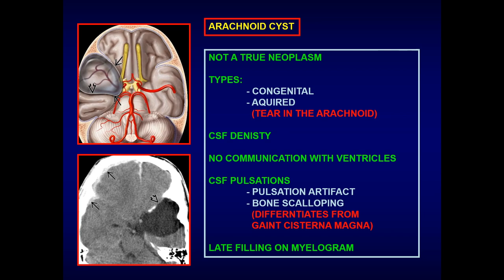The two key differentiators from epidermoid are: the dirty CSF sign on FLAIR — which is absent in arachnoid cyst, which remains completely dark on FLAIR following CSF intensity — and restricted diffusion, which is present in epidermoid but absent here. The arachnoid cyst is dark on diffusion sequences with CSF intensity on all sequences. There may also be a pulsation artifact in the phase-encoding direction.